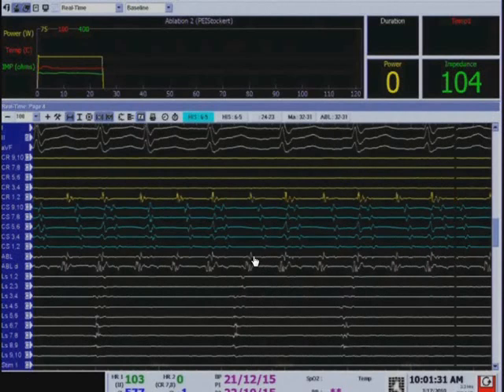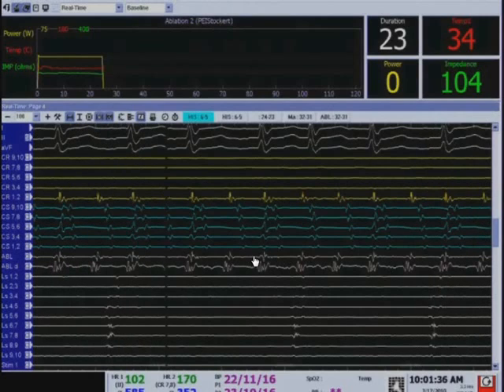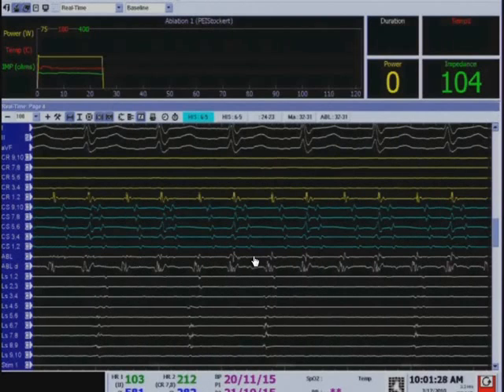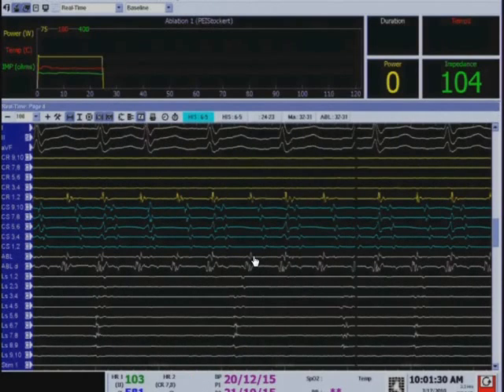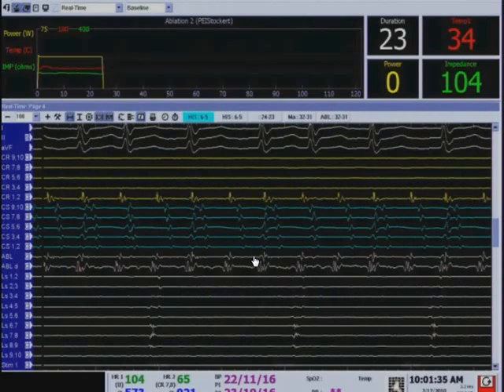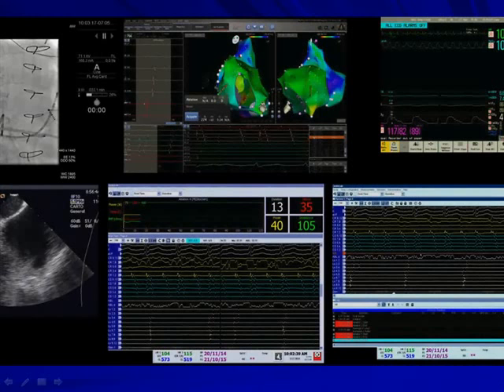So it's a little hard to orient yourself, but these are the signals from the circular catheter, which is placed near the SVC, but frankly, they represent the remnant heart here. And so the remnant heart is beating at a slow, regular rate. The pulmonary sinus and the distal coronary sinus were beating rapidly, so they were clearly completely separate from each other. And in this particular case, there was no point in isolating the left veins like you might strategize. Actually, you just needed to ablate within the pulmonary sinus to eliminate it. I believe this is also moving.